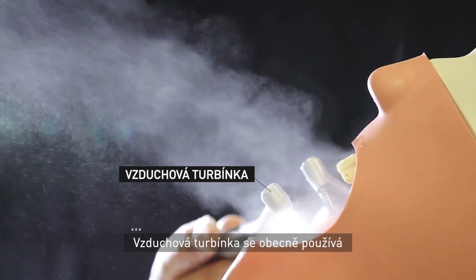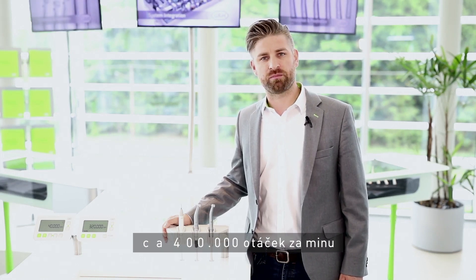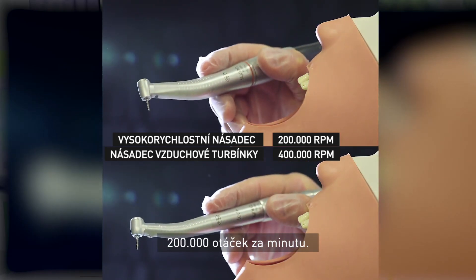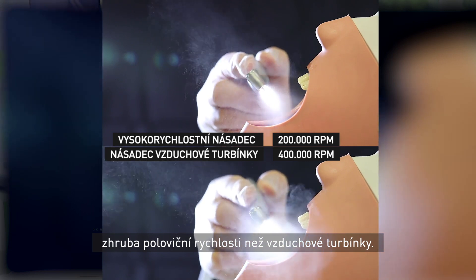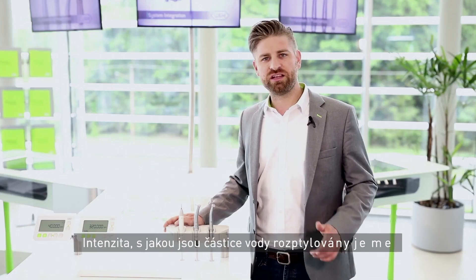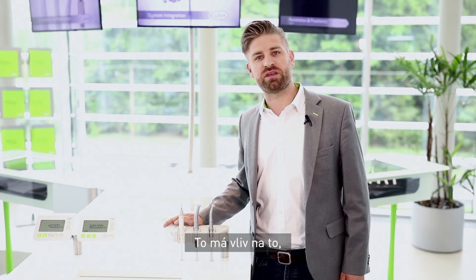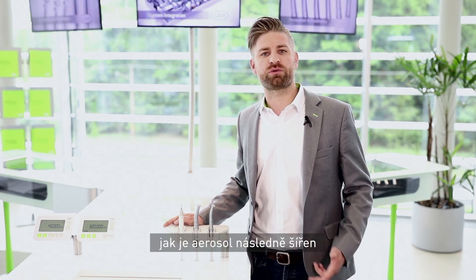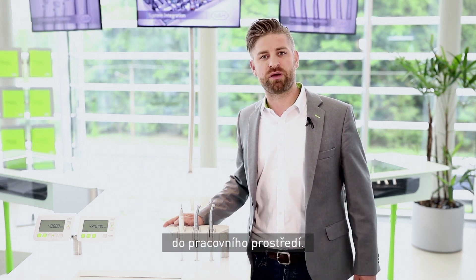Air turbine handpieces run at approximately 400,000 rpm. Electric high-speed handpieces are operated at 200,000 rpm — half the speed of air turbine handpieces, and that's the key. The intensity with which particles are distributed is less, and this has a beneficial effect on the way aerosol is distributed into the operatory environment.